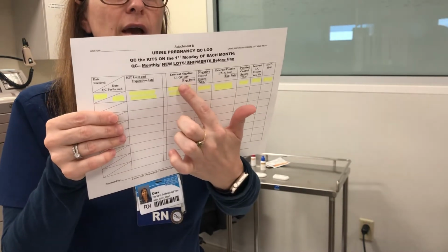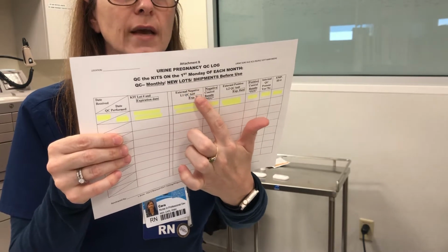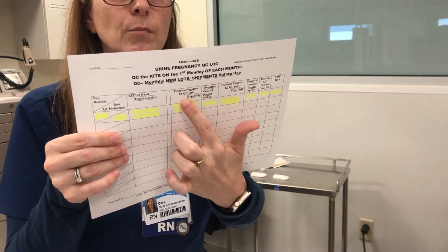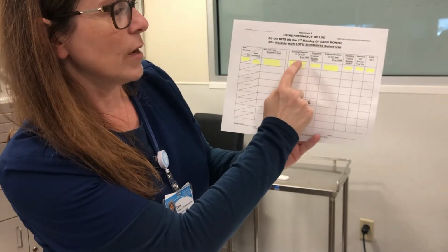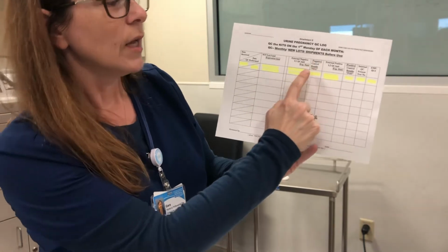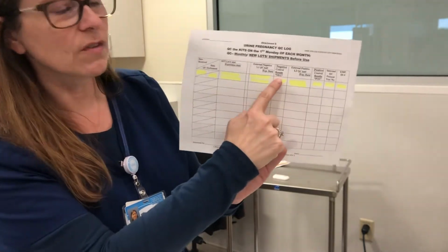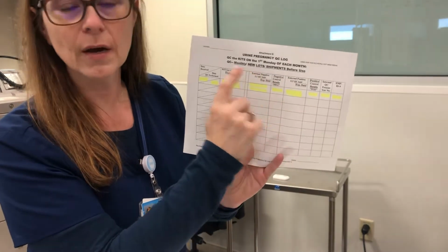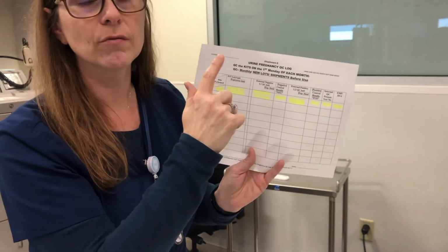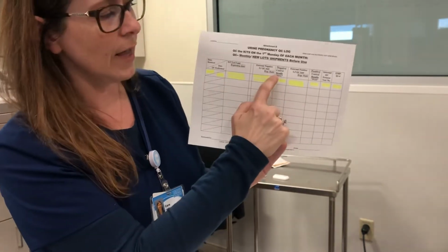You're then going to write your external negative controls. So it's level 1 control, which is your negative. You're going to write the lot number and the expiration date in the next one. Anytime that words are written in the parentheses, they want that exact verbiage on this form. So it says negative, NEG. You need to write NEG. You cannot write a negative sign. You should not write negative all the way out. It should literally say NEG.